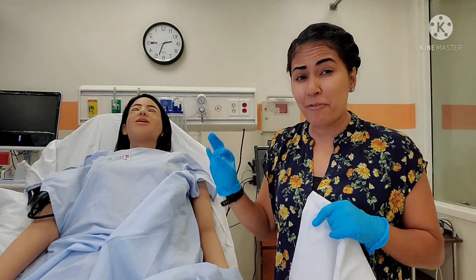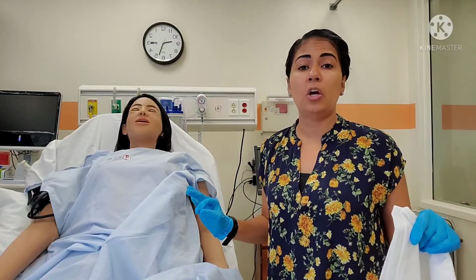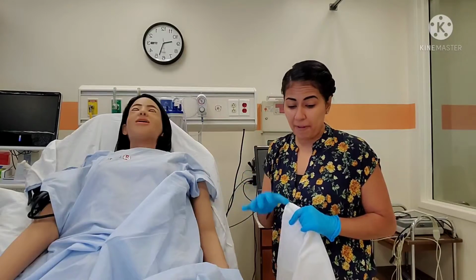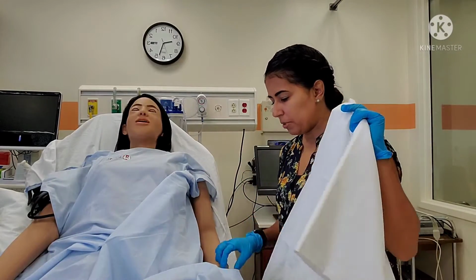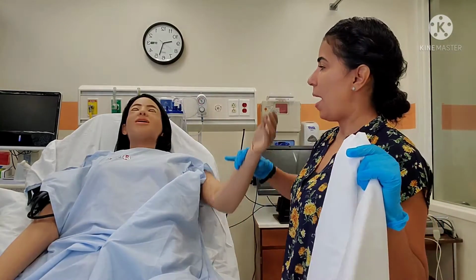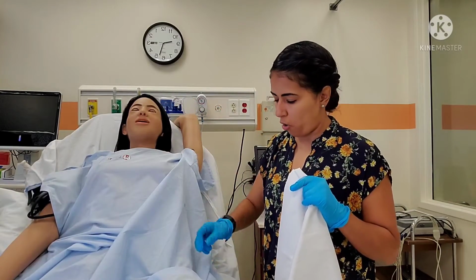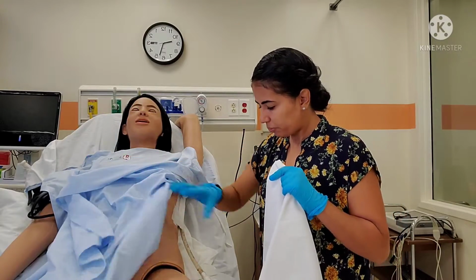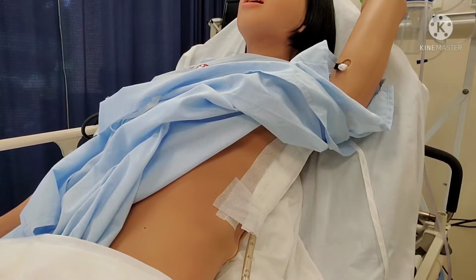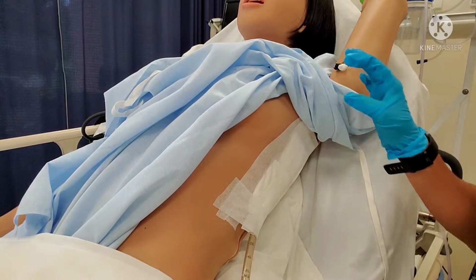Every time I'm walking in the room, I'm doing this because at any point, something can go wrong with my chest tube, and my patient is going to be my first sign that something's wrong if I didn't catch it beforehand, right? All right, so what I'm going to do for Jamie here now, she's a mannequin, so she can't move her arm where I want it to be. So I'm going to move her arm up here. In the real world, you don't need to do that. You'll just ask your patient to move their arm to the side, okay? And I'm going to put a little blanket here. Now, keeping in mind that things are not going to be exactly the way they would be in the hospital, in this simulated environment, we try to make it as realistic as possible.